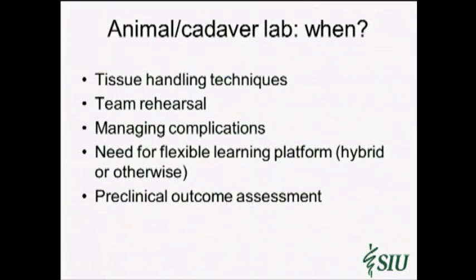Now, Ted showed nicely some of the things that can be used apart from the kind of curriculum and testing tool that we've developed here with FES. And when are they most important? Well, these are some of the areas in endoscopy where I think as an educator you ought to think about incorporating these kinds of elements, because they're harder to teach on a purely simulated platform. If you want real tissue handling and haptic capabilities, if you want to rehearse a team event, if you want to learn how to manage a complication and be able to simulate that, in these kinds of settings, we will need to use animal or cadaver lab type experiences.